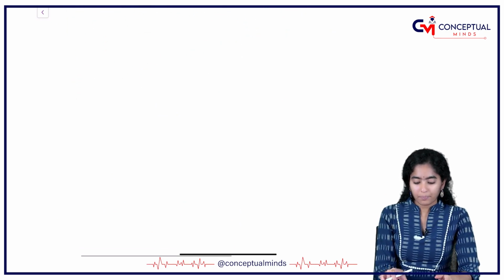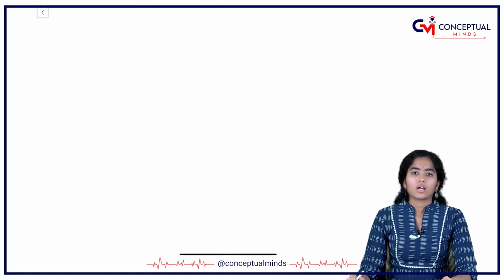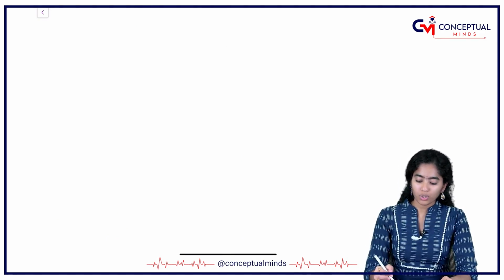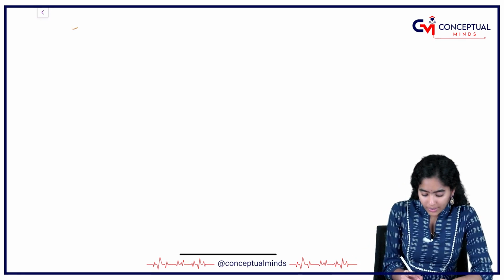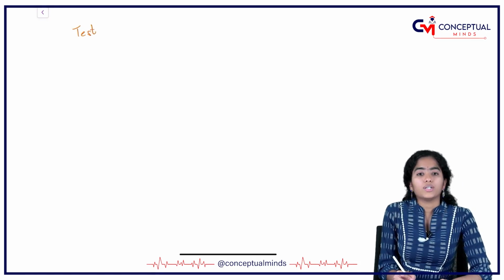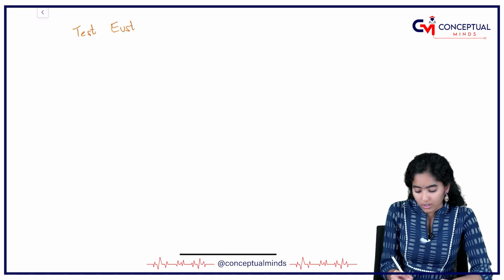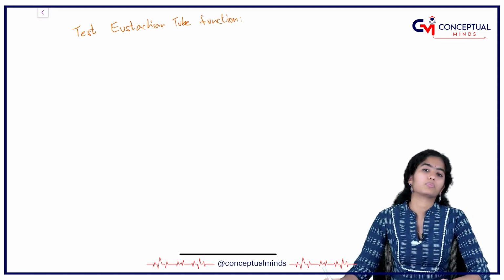So with a tympanogram, we can find out the compliance of the tympano-ossicular system. There is one more use of tympanogram, and that is to test the Eustachian tube function. For that also we can use tympanometry to test the function of Eustachian tube.